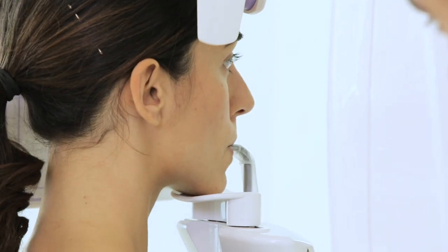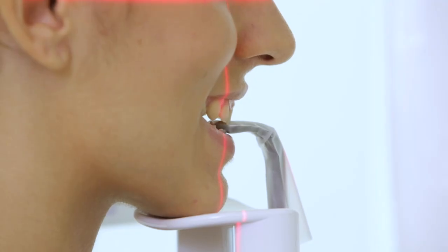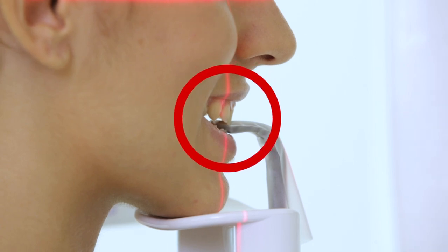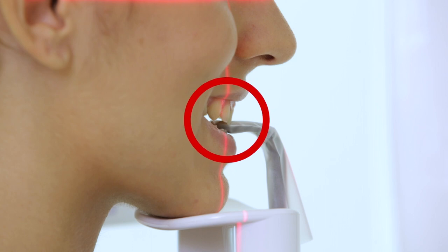By adjusting the height of the bite, the dentist asks the patient to make sure her incisors are in the groove, so that the incisor's interproximal space is aligned with the bite's midline.